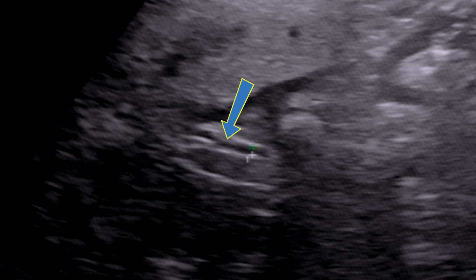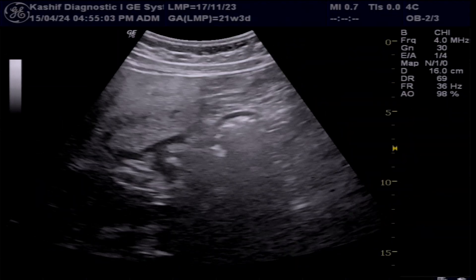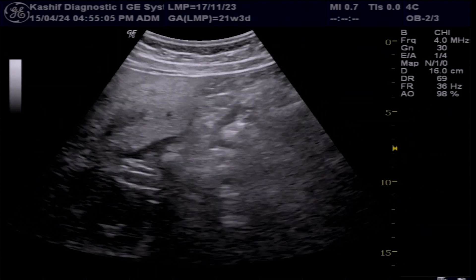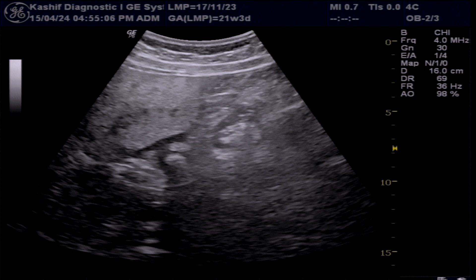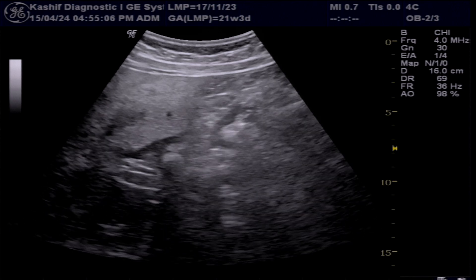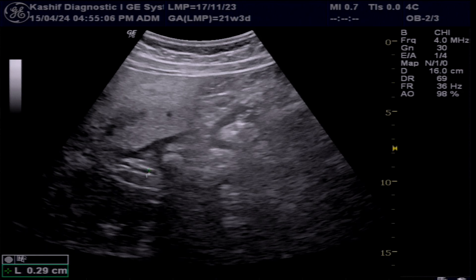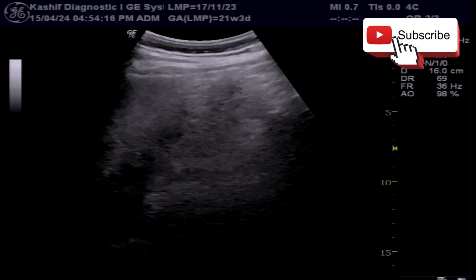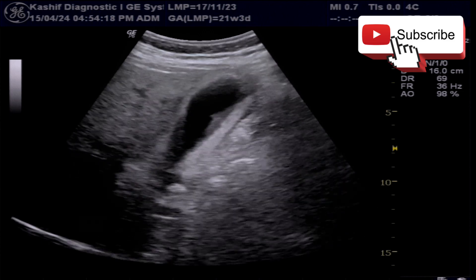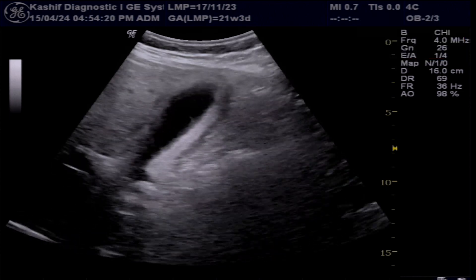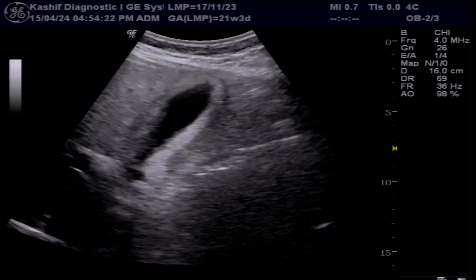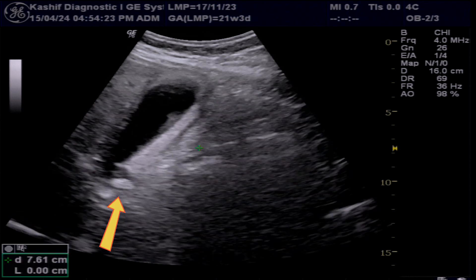The various causes of a distended or enlarged gallbladder with infection include acute cholecystitis or obstruction in the gallbladder neck, cystic duct, or CBD. There is no obstruction in the CBD. Visualizing the neck of the gallbladder, we can see there is a large stone of 15 millimeters obstructed in the neck of the gallbladder.